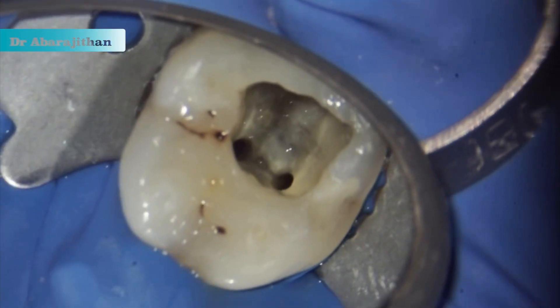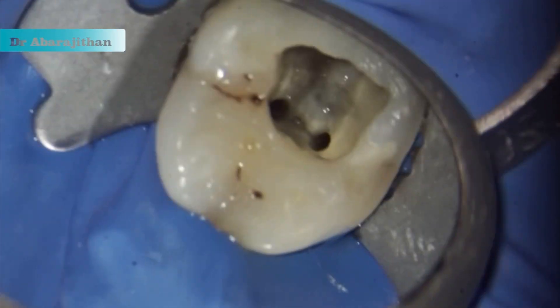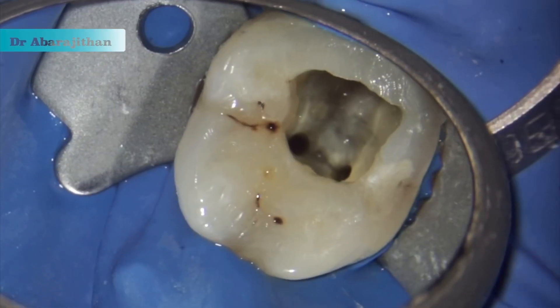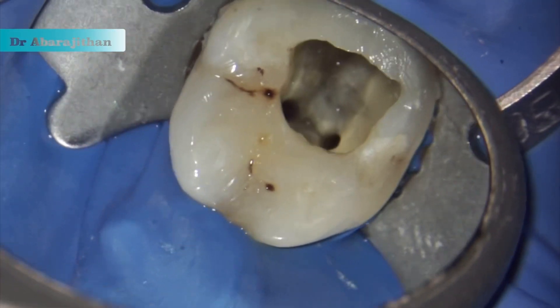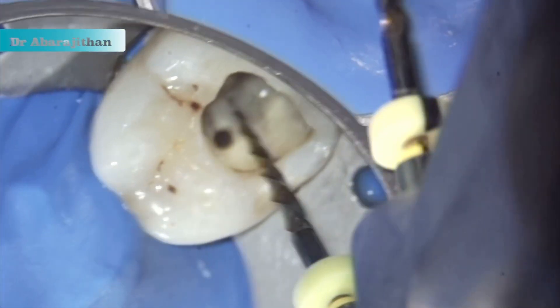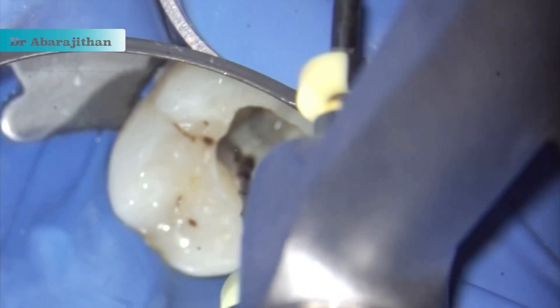Now we search for the extra canal. I could suspect a middle mesial canal as I can see an increased distance between the mesial buccal and the mesial lingual, and I can also see a catch point felt with the DG16.